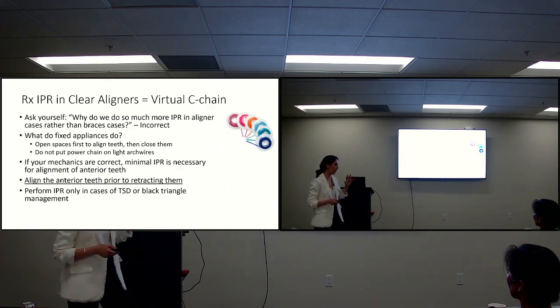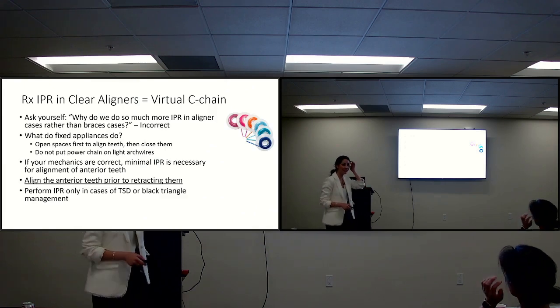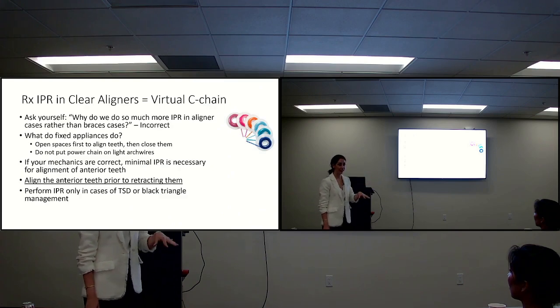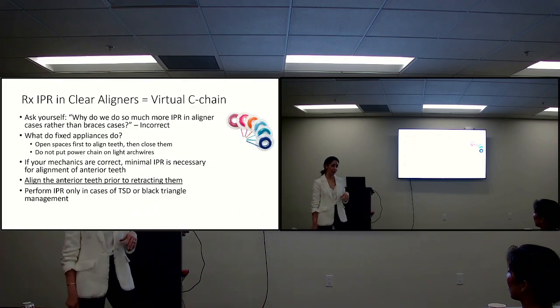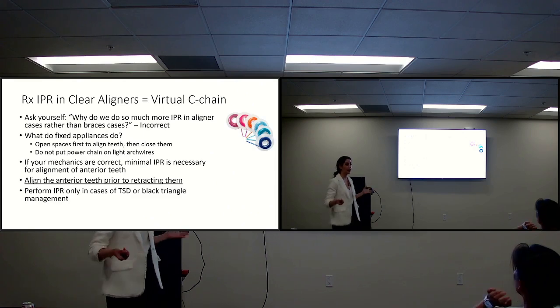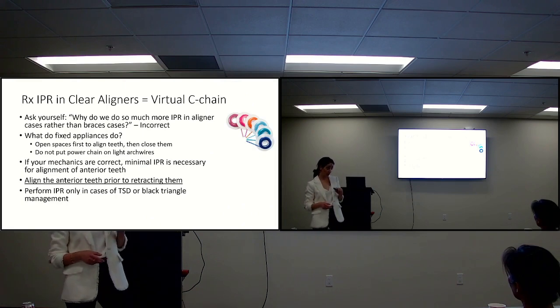In the past year or so, actually a couple of years, I feel like I've had an epiphany in Invisalign. My cases track so much better. And here's something I want to tell you guys. The ClinCheck itself is not how teeth move. They're now figuring it out, and they now have this thing called IPP, individualized personal plan. Have you done your IPP, Mike? Yeah. So they figured out that their tracking, the way they move teeth in the system, is not how teeth actually move, and they're now getting better at it. So take that ClinCheck with a grain of salt.